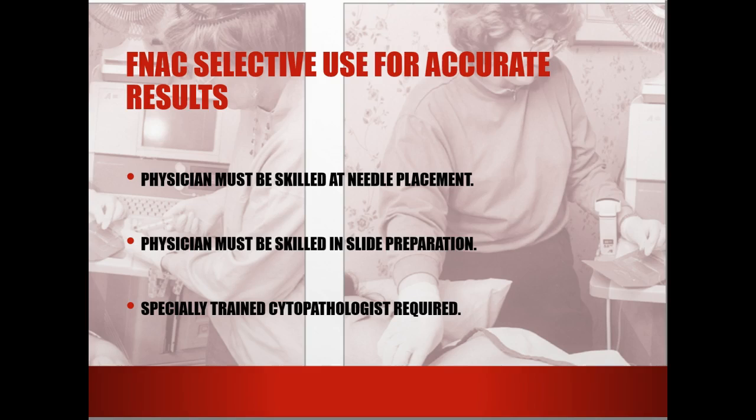It also gives the patient a rest to where they're not going through so much. Sometimes these patients have to come to mammography, get the needle put in so that the guide wire can be placed in the mass. She's taped all up, sent over to the surgery center. She may have to go to nuclear medicine so that they can localize a sentinel node because they're going to remove that too, and then she goes to surgery. So it can be a long, long day. If we could eliminate having to have the needle localization that same day, we can eliminate 1 to 2 hours from her whole process. So that's just what I wanted to comment on with that new technology.